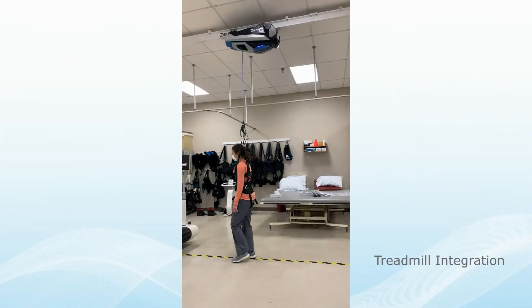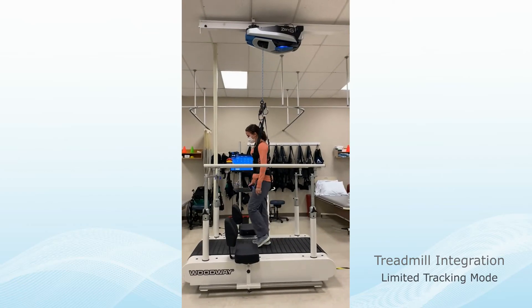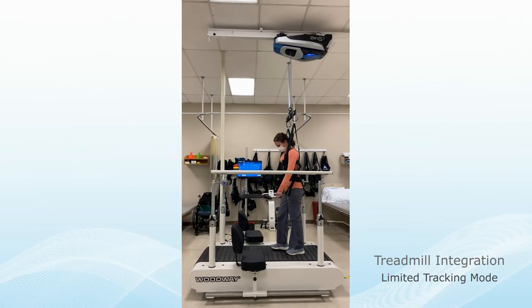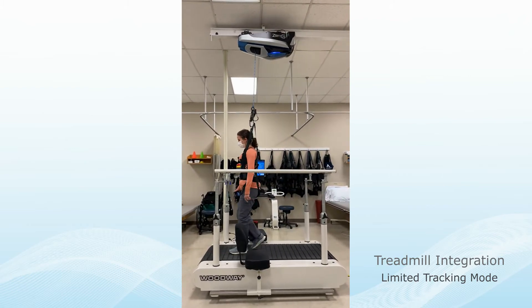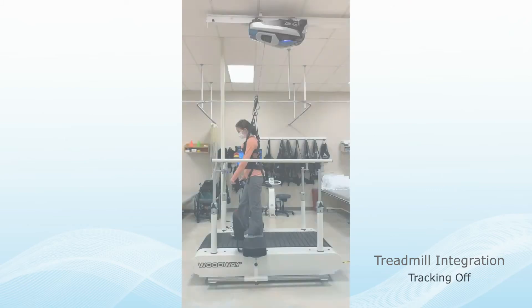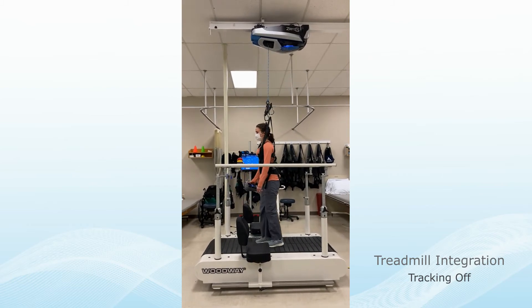There is also the option of adding a treadmill to integrate into the Zero-G controls. The treadmill speed and incline can be controlled through the Zero-G touchscreen. Zero-G can be used in Limited Track Mode, which allows the robot to move in a restricted area of the track so the subject can move freely along the treadmill. If this is too challenging, the tracking can be turned off to lock the robot in place.